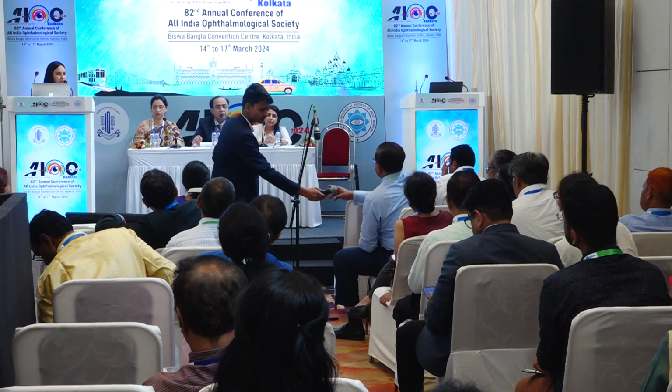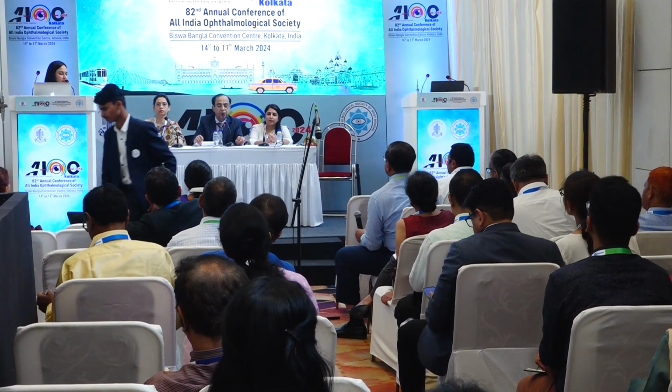So, no, I think I will not discuss the chopping techniques. But of course, when your bevel is down, sealing is easy because the bevel is down and it can seal very comfortably when you are doing a direct chop. But at the same time, many of us don't feel comfortable when we don't see the tip.